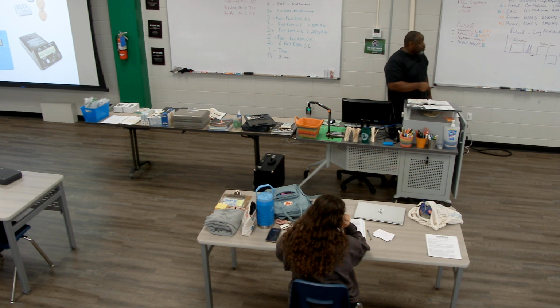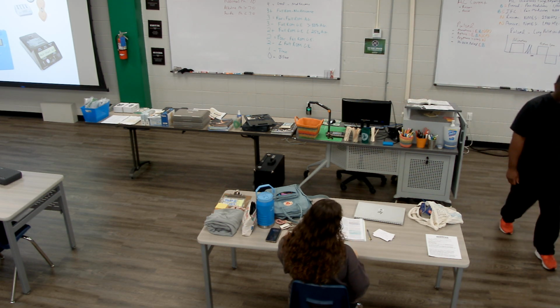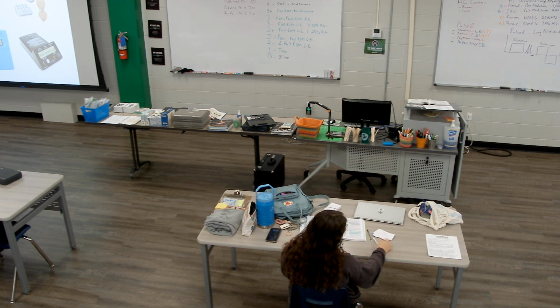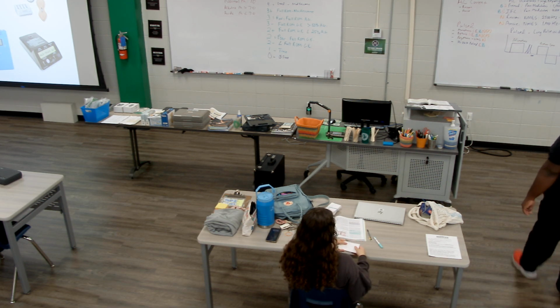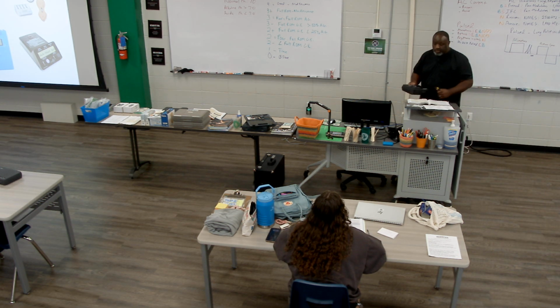These are still used clinically. A lot of places still use this old blue iontophoresis unit. It only has one channel, and it only sets up to do iontophoresis. It does not do anything else. So I can't set this up to do a treatment for pain or set this up to do a NMES. It only functions as iontophoresis.